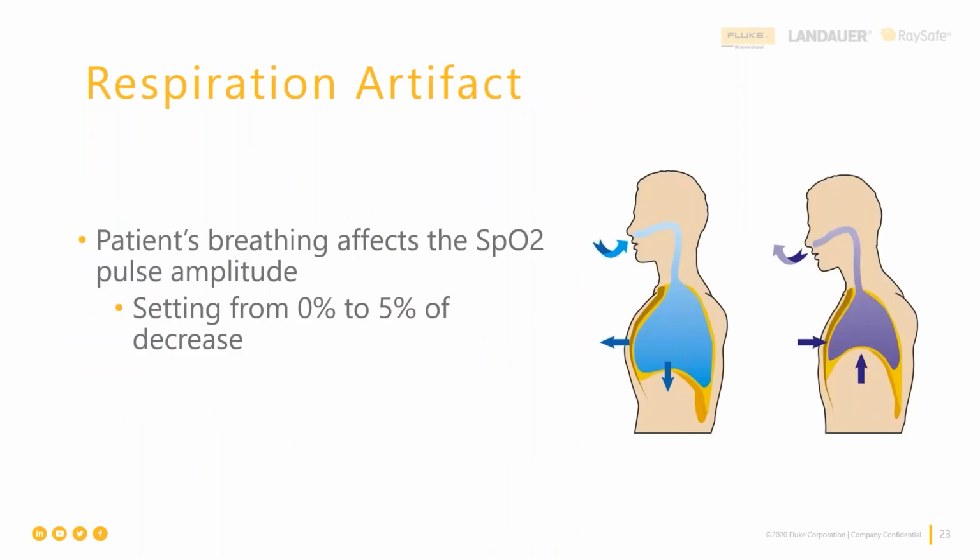All right, so why don't we jump onto the last artifact we have? Respiration artifact. So as the patient breathes in and out, there's motion, and because the chest typically is rising and falling, and this has to do with the health of the lungs and the proper function of the lungs. So respiration artifact also can cause some problems in a pulse oximeter being able to actually make the proper measurement. By the way, it also gets in the way of invasive blood pressure measurement. It gets in the way of ECG measurement sometimes by introducing artifact onto the QRS complex.